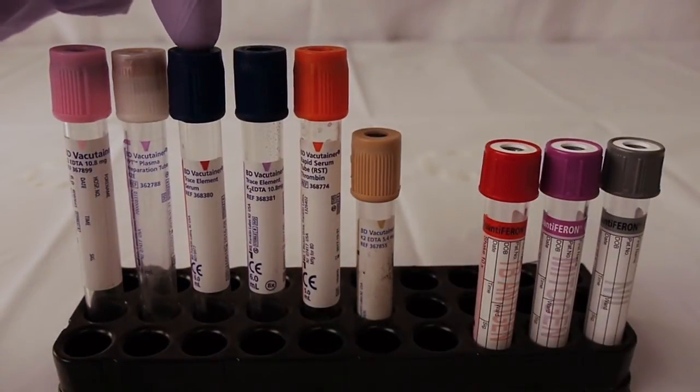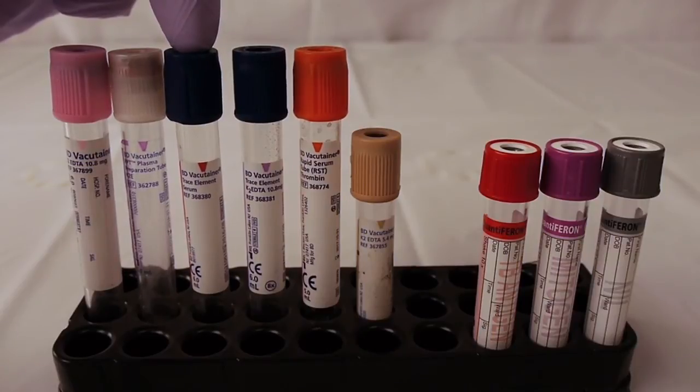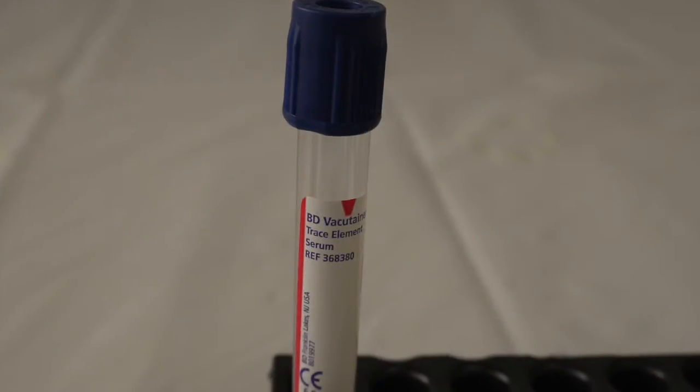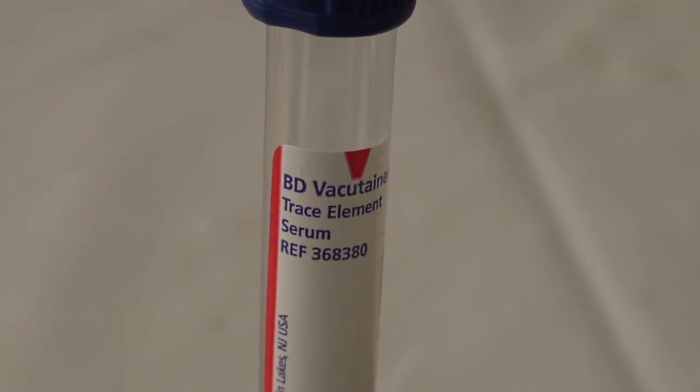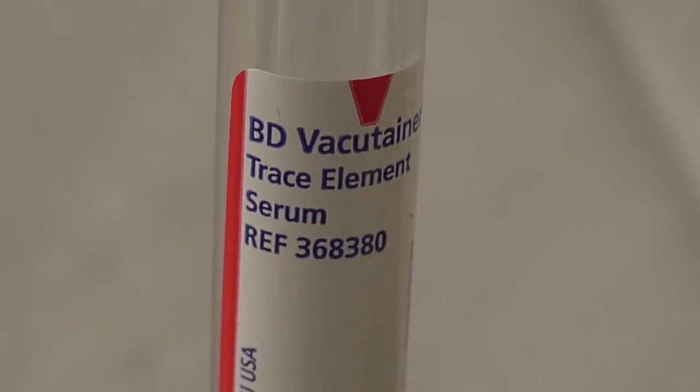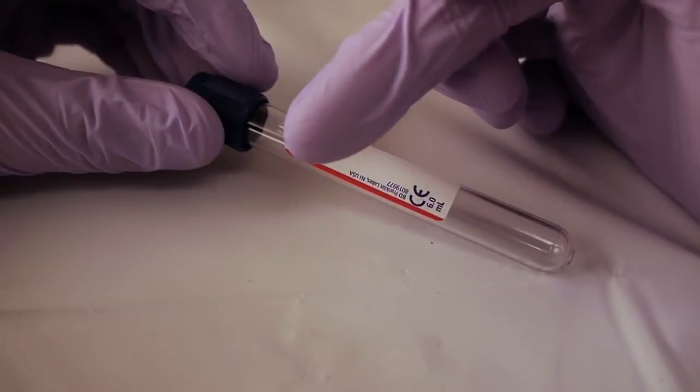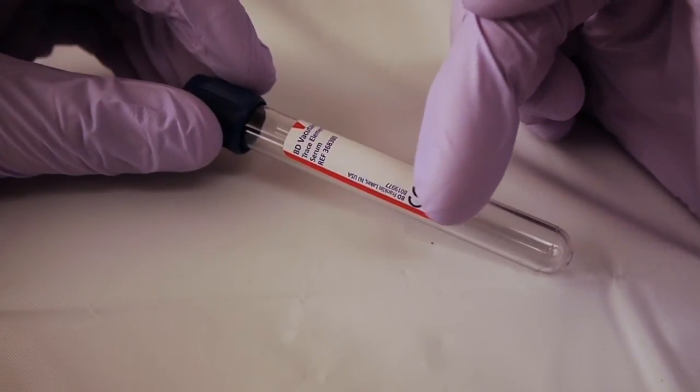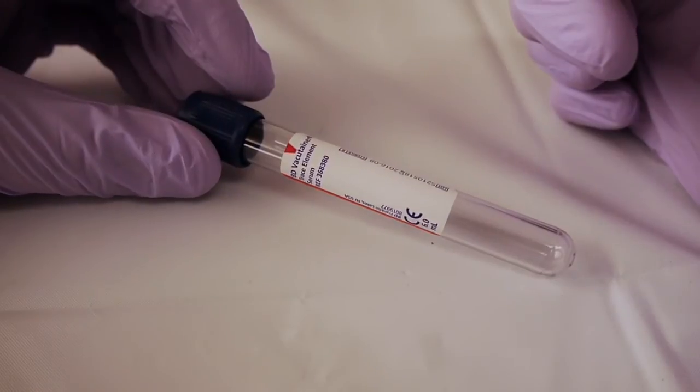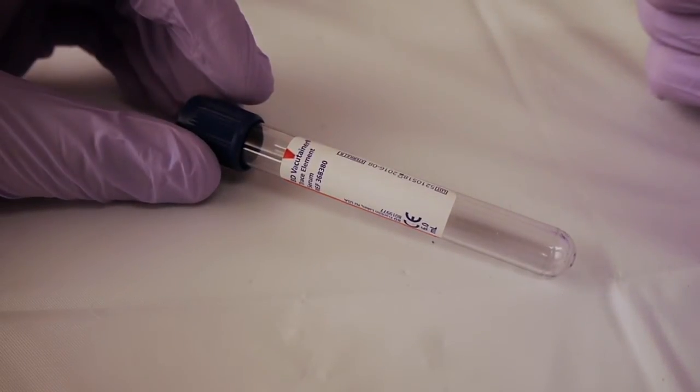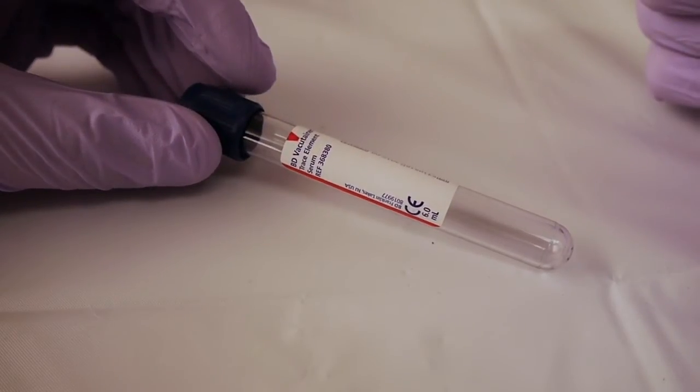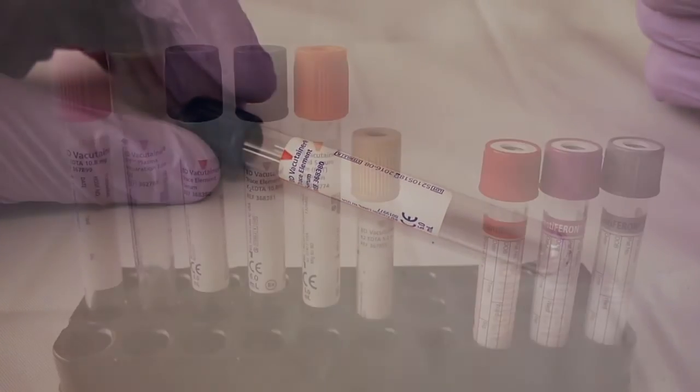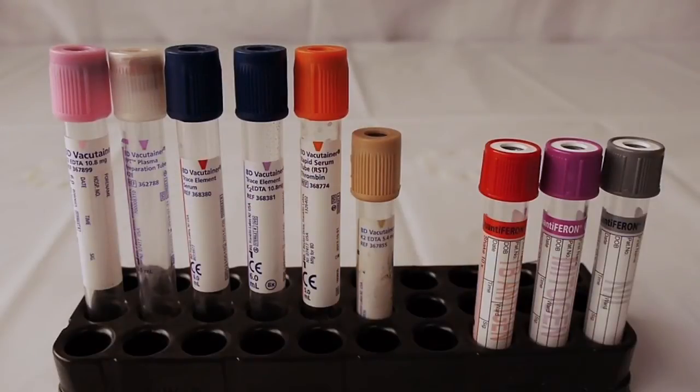The next tube is the Royal Blue Tube. This tube is used for trace elements, toxicology, and nutritional studies. This tube, if you look carefully on the left-hand side, it has a red stripe that goes down the label.